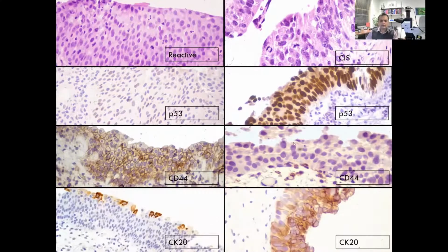So that's good too. And finally, our other marker is going to be CK20, right? And in reactive proliferation, we get CK20 staining only on the superficial or the umbrella cell layer. And that's exactly what's happening here. Whereas in contrast, CIS, you will get a full thickness epithelium. So this is the ideal scenario, and the stains work as you expect it to work, but this is a case where you can easily make a diagnosis by morphology alone. So let's take a look at another case.